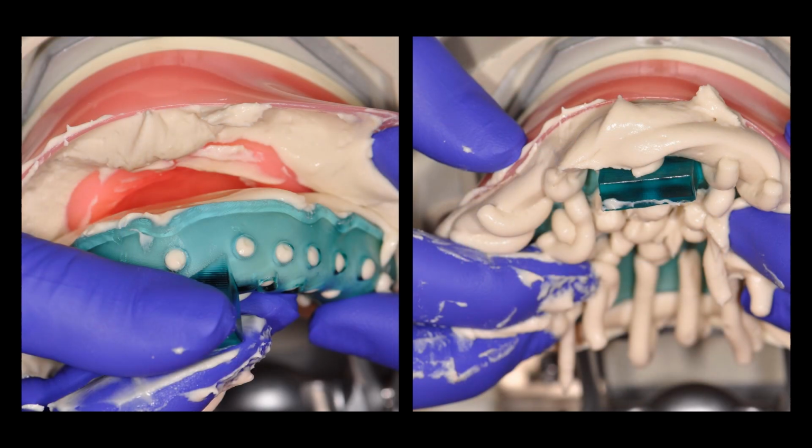With your loaded tray, you'll first position the tray posteriorly and work your way to the anterior portion. Once you've done that, make sure you apply pressure vertically towards the palate and support your fingers bilaterally on the tray. This way, you'll distribute those forces equally on both the right and left side. If you don't apply this pressure, you won't capture the vestibule properly.